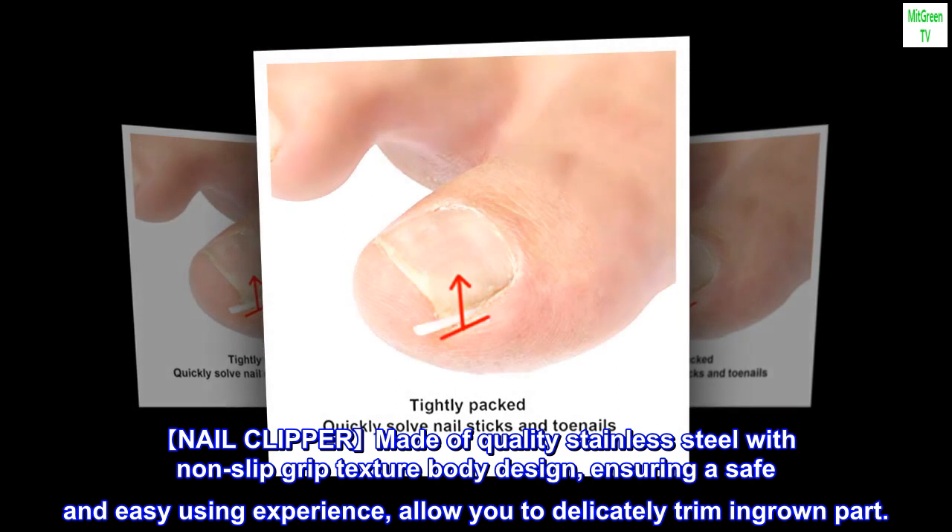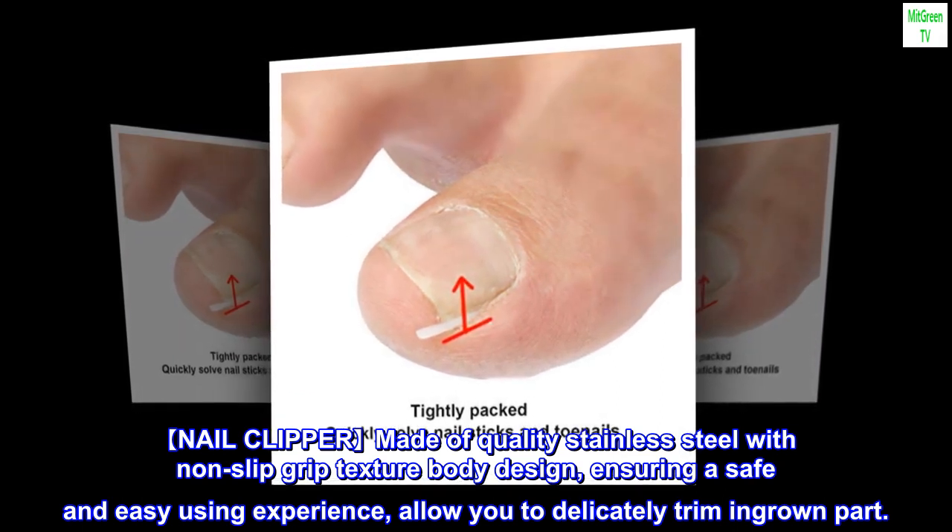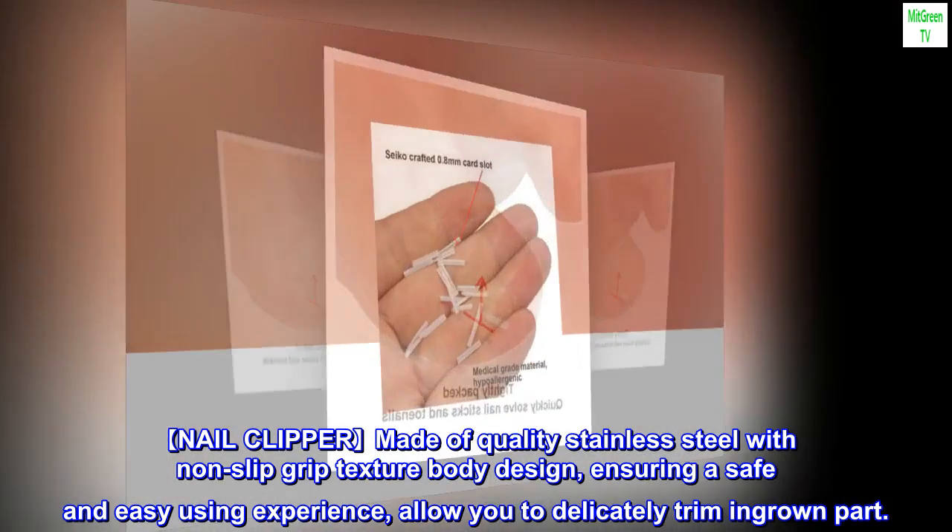Nail clipper made of quality stainless steel with non-slip grip texture body design, ensuring a safe and easy using experience, allowing you to delicately trim the ingrown part.